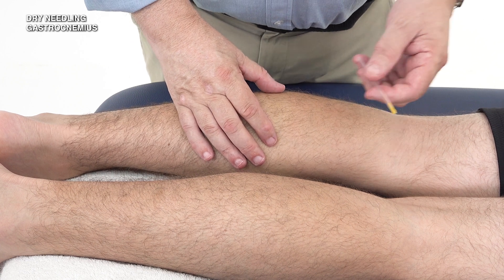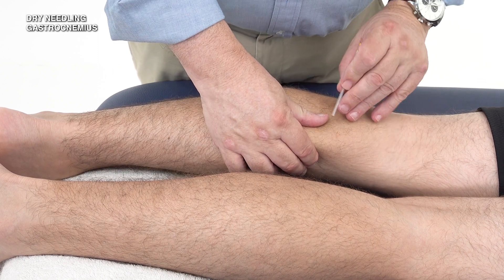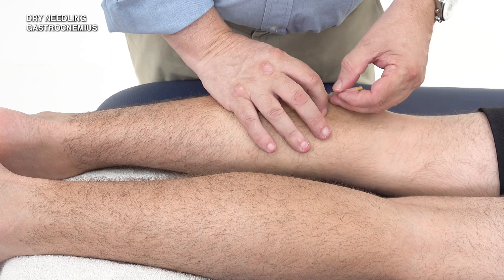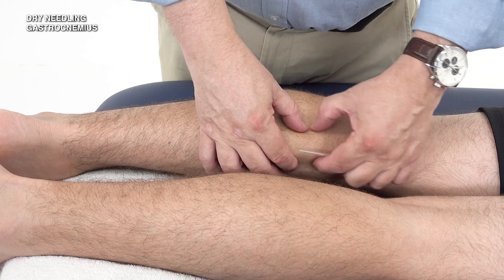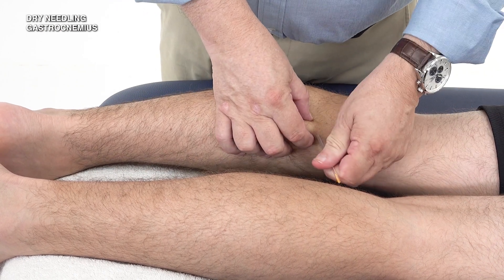We will insert the needle into the gastrocnemius muscle. You can pinch the muscle, find the trigger point, and use a lateral to medial direction for the medial head, or a medial to lateral direction for the lateral head. The idea is to isolate the muscle and the trigger point, and then insert the needle accordingly.